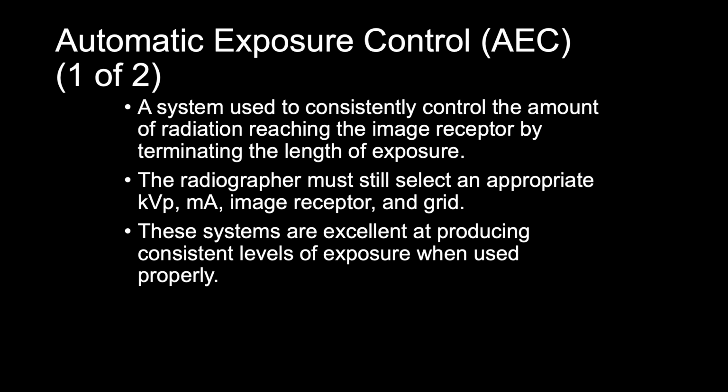So even though we have an AEC system and the techniques already calibrated into the equipment, we can change the KVP, the MA, anything that we want.